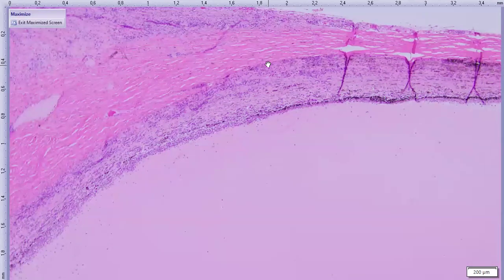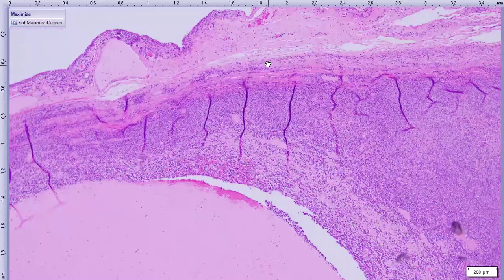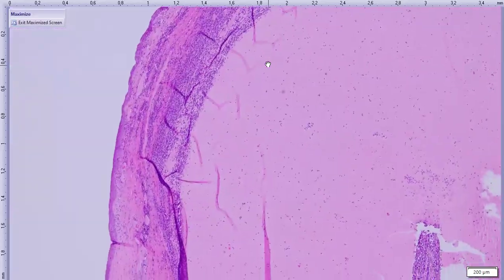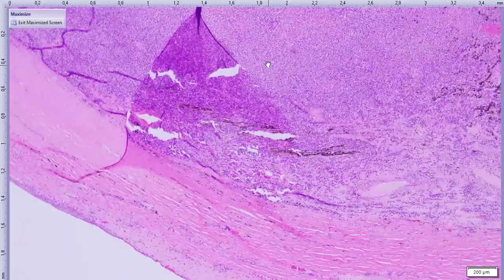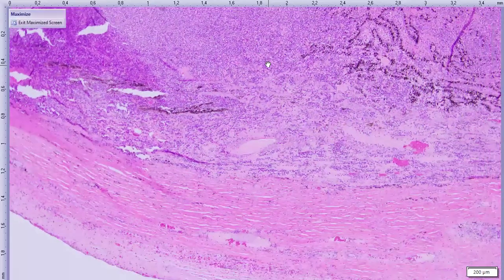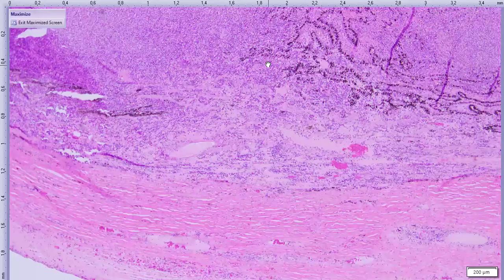We do offer immunohistochemistry through Cornell University for FIP. It's nice when it's positive, but a negative result does not rule out FIP. And then, just to close up their concern for anterior segment dysgenesis in the other eye, there was just so much distortion of the angles in this globe from the buphthalmia and the inflammatory infiltrate that it was really hard to give them any clue if there is any malformation in the angle in this case as well.